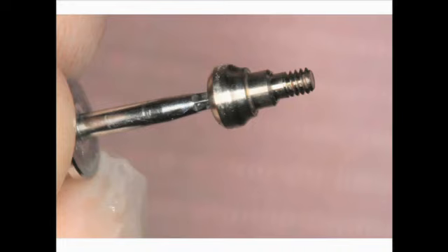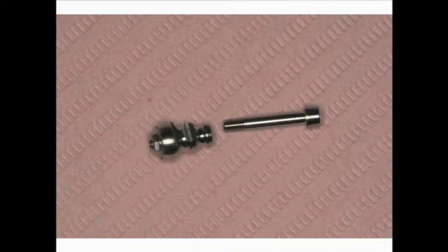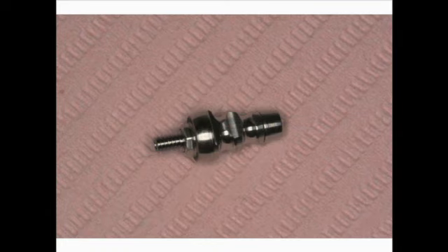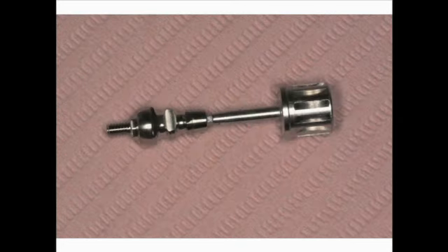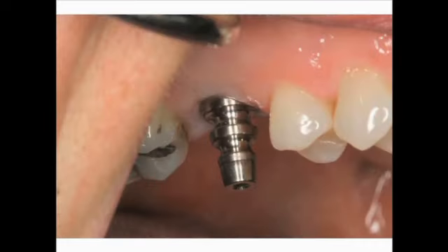So here we have to remove the healing abutment from the site, from the tissue. We're going to save this because we will put it back in a few minutes. A direct impression is planned. The impression system is a two-piece system with an octagon base which engages the internal design of the Cybron implant and the screw which threads it into position. A hex tool is used to place the impression coping. The two-piece impression coping is inserted into the implant.